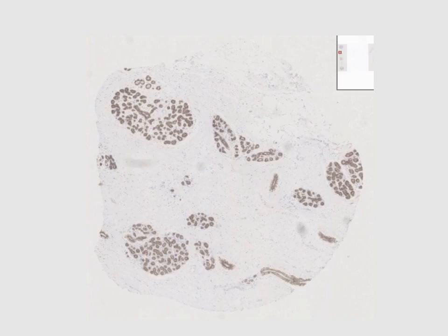The second control is a section of the normal breast, and we can see that there are well-maintained lobules and ducts, and there is no evidence of infiltration of tumor cells, and all the positive staining is at the correct locations, suggesting that our own staining is also correct.